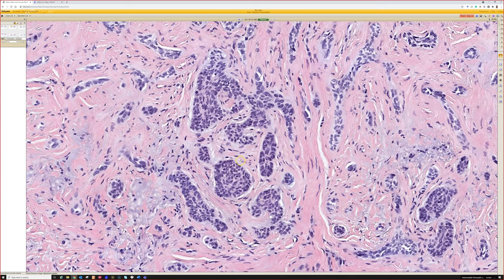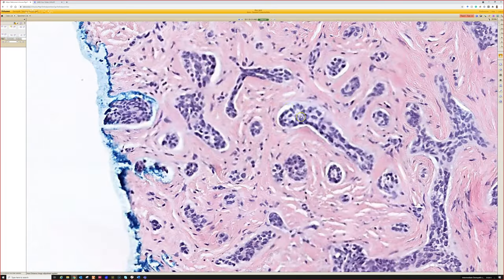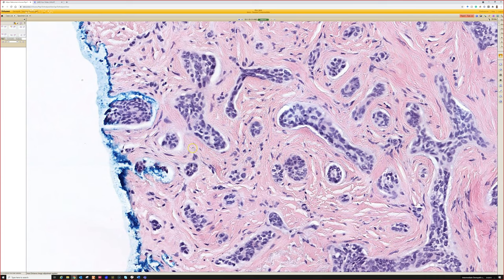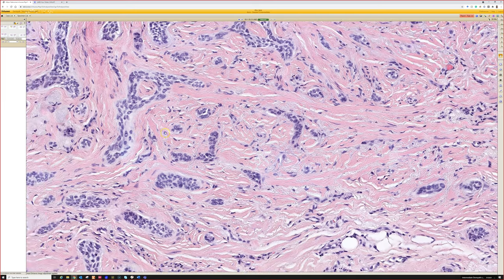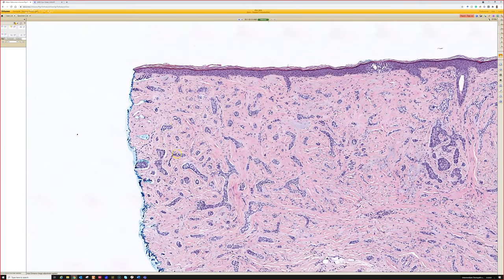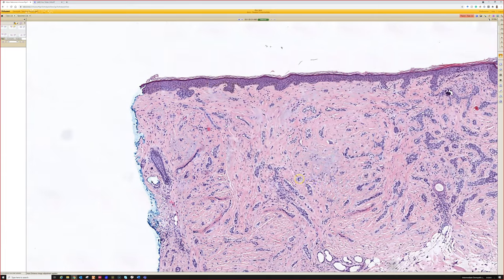But in real life, I find that this is rarely a struggle because usually there'll be other elements that are more nodular. And then here you've got the palisading and the mucin-filled clefts. And you can see a nice clefting over here also, see? See good clefting? So usually you'll find some areas that look like that. But in the most morpheiform areas, you don't get good palisading. You don't get good mucin or clefting. You don't have the typical stroma. It's more dense stroma. So in these areas, yeah, you could struggle with figuring out what this is. But just look around and find the other areas of obvious basal cell, and that usually will solve the problem for you in most cases.